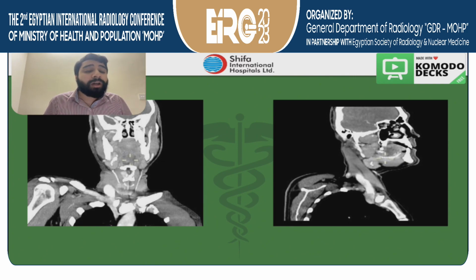The whole of Wharton's duct is dilated with extensive calculi, and this patient was then referred, however the patient was lost to follow-up. Otherwise I would have shown the post-op images as well. Unfortunately, in a country like Pakistan, we usually lose patients to follow-up because of their financial and economic status. Otherwise this was a very rare presentation, and that is what I wanted to share with you. Hopefully you liked the case.